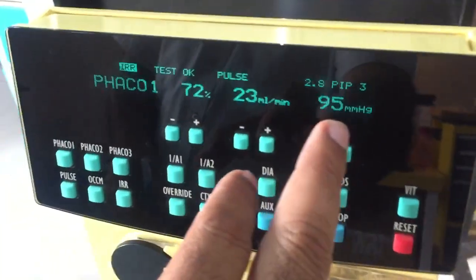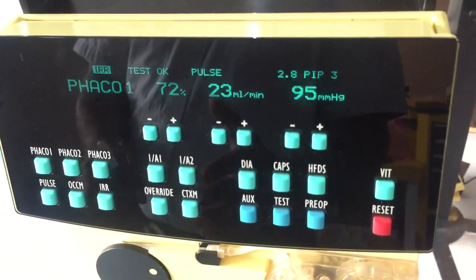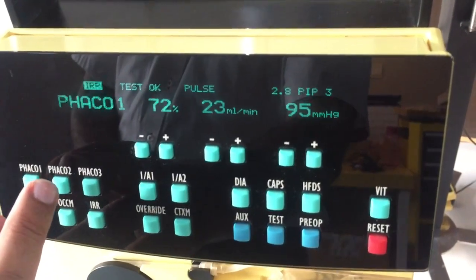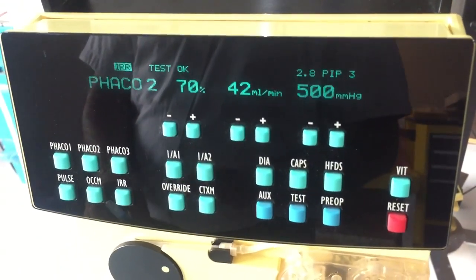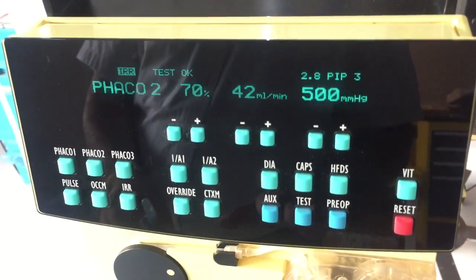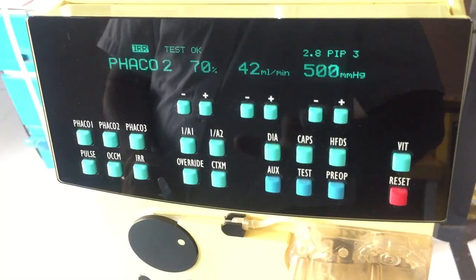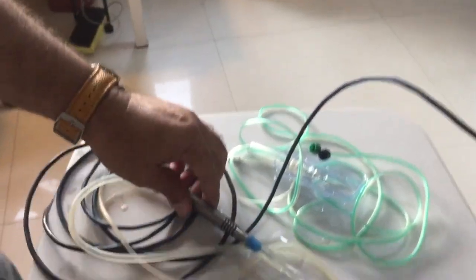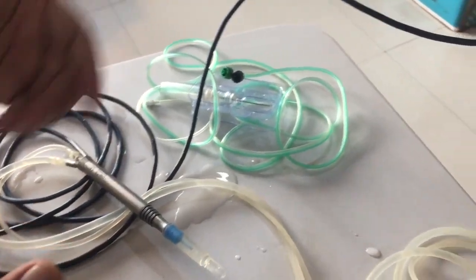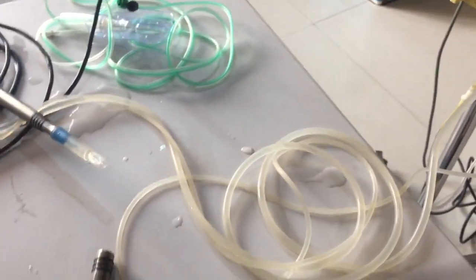This phaco 1 setting is for the sculpting. After sculpting, after breaking the nucleus into 2 or 3 pieces, then you press the button phaco 2. Remember, this option you can also do with the foot pedal. You can change phaco 1, phaco 2, phaco 3 in the right direction horizontally. So your system is ready for the phaco, and the second step is the I&A.